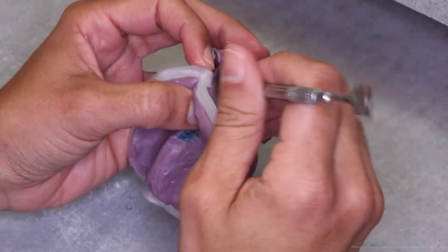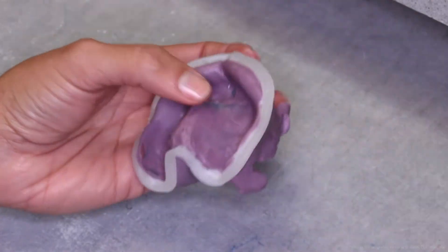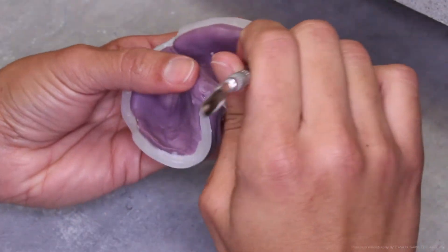Once the utility wax is fully wrapped around the borders of the final impression, be sure to seal the two ends of the utility wax together.